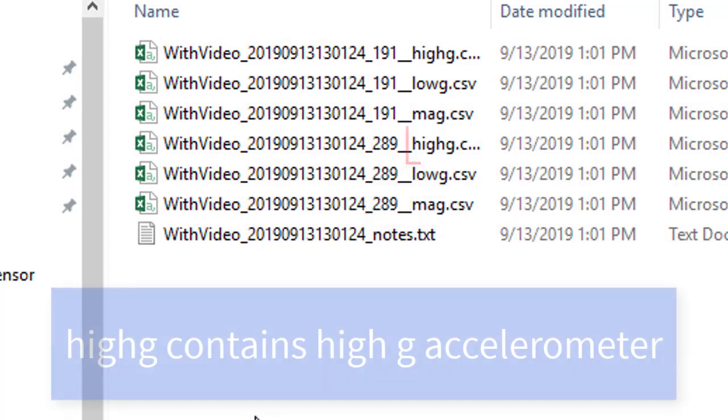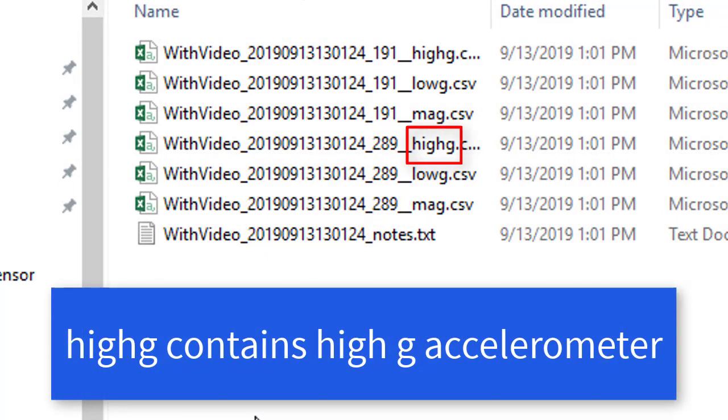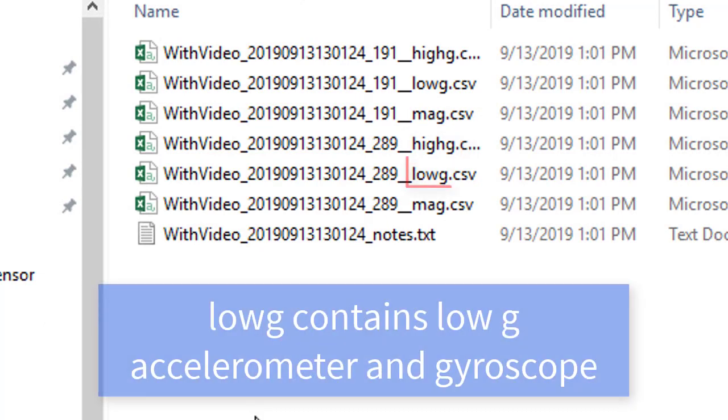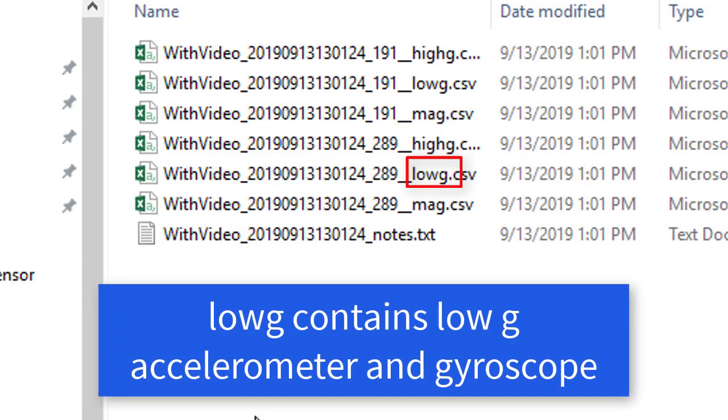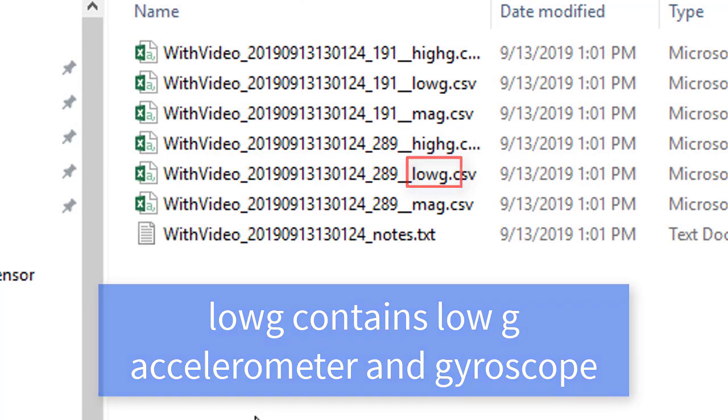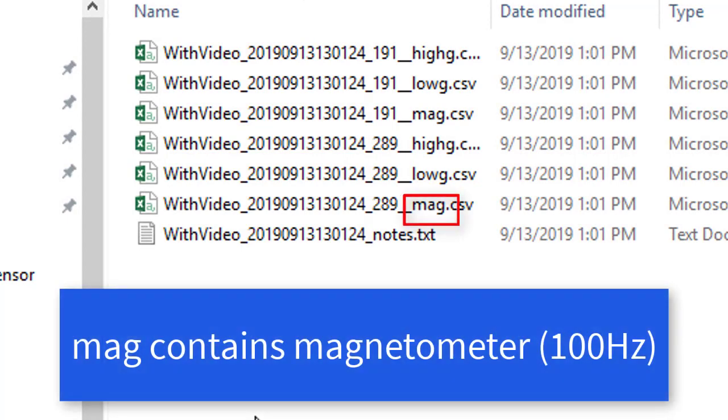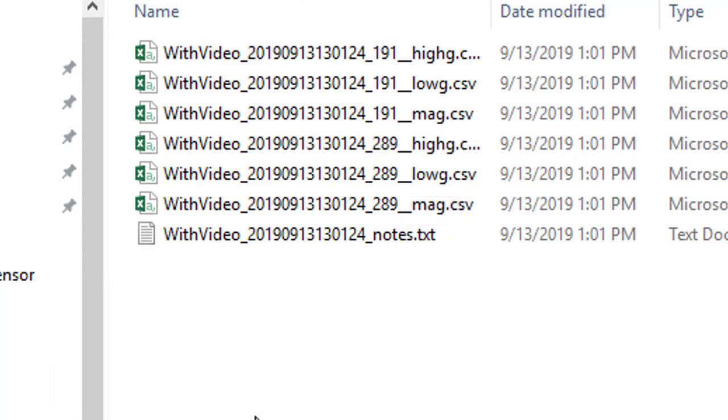High-G contains the data from the High-G accelerometer. Low-G contains the Low-G accelerometer and the gyroscope. Lastly, the MAG file contains the magnetometer data which was separated because it only collected at 100 Hz.